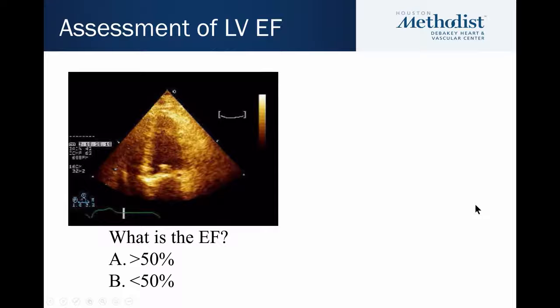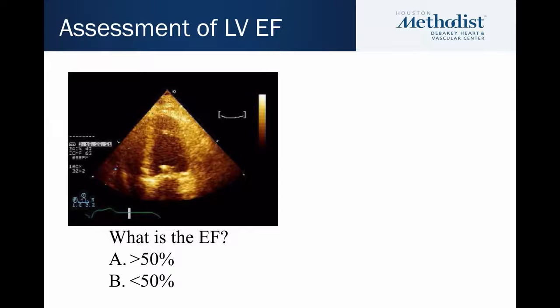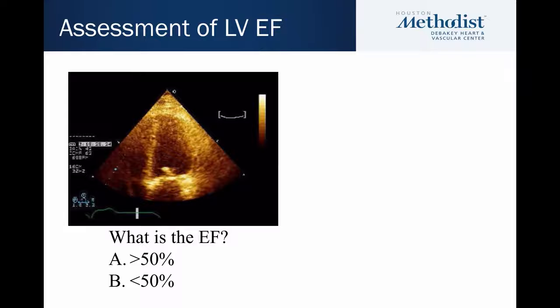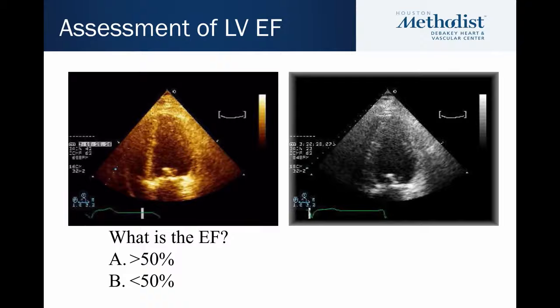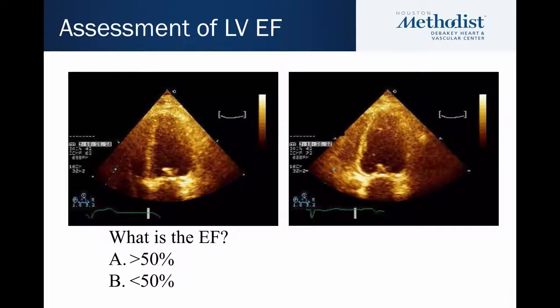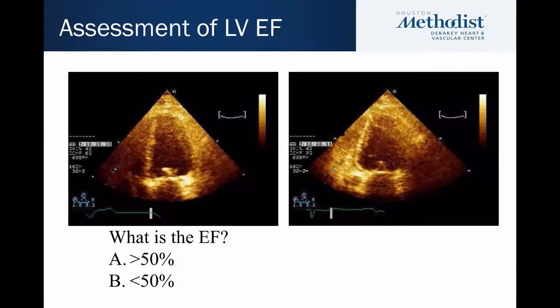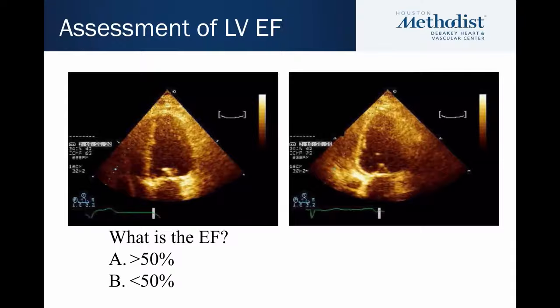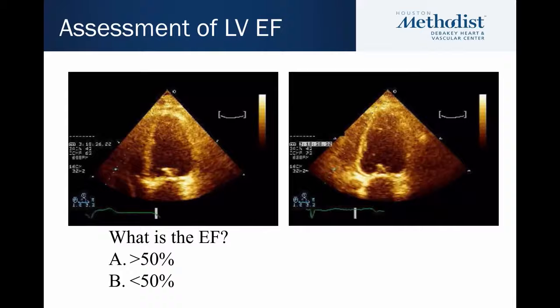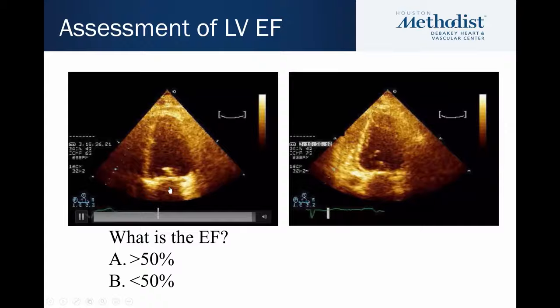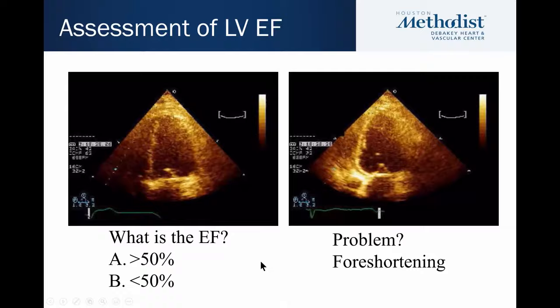We're going to start by showing a case and having each of you estimate the ejection fraction. Many of you would say the ejection fraction is probably 50% or better. Now this is the same patient — look at the EKG, it's identical, taken less than a minute later — and now we would all say that ejection fraction is clearly abnormal and depressed, not 50%. Also notice the left ventricle looks much bigger on this view. This is an example of a very common problem in echocardiography: the problem of foreshortening.